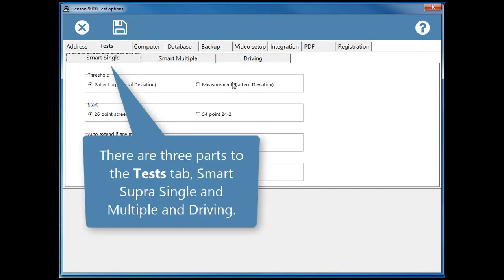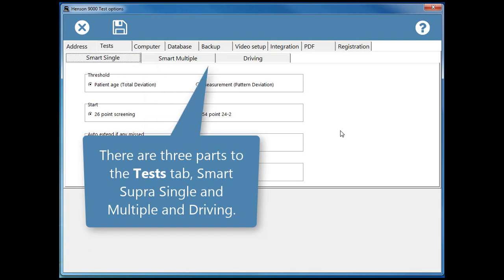There are three parts to the Tests tab: Smart Supra Single and Multiple and Driving.